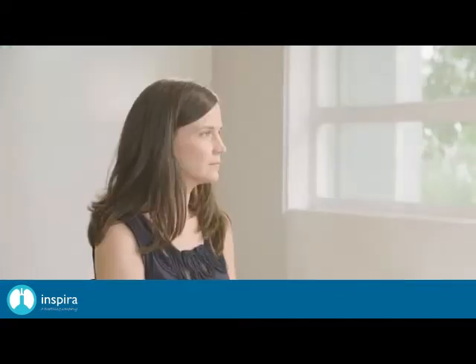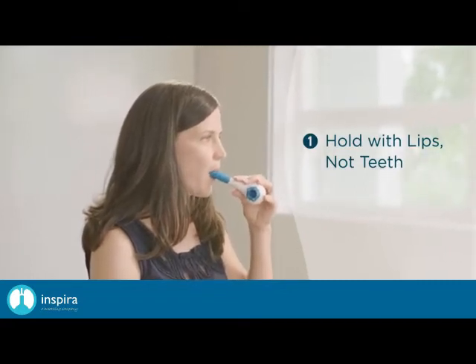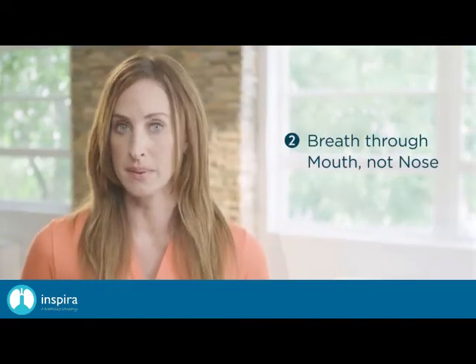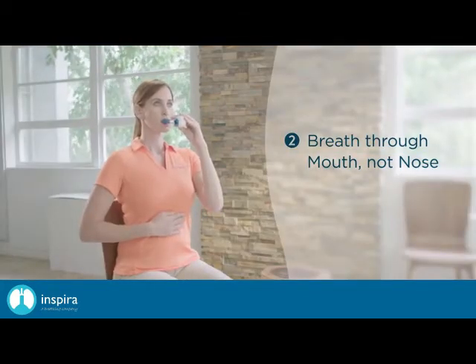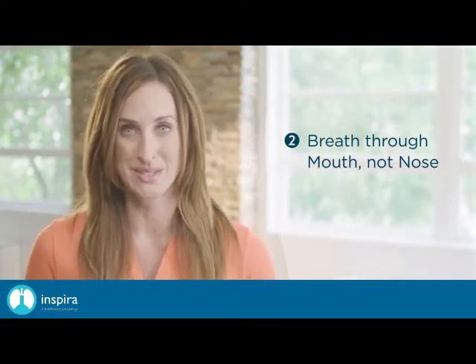During your first session with the patient, be sure to instruct the patient to hold the mouthpiece with their lips, not their teeth, as this may cause undue jaw pressure and inadequate lip seal. Ask the patient to breathe in and out through the mouthpiece, not their nose. Instruct to inhale deeply and forcefully for 2 to 3 seconds. Slight pause, then exhale forcefully for 2 to 3 seconds.